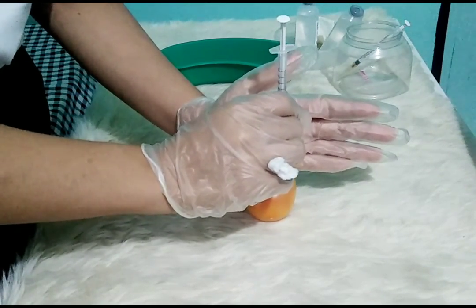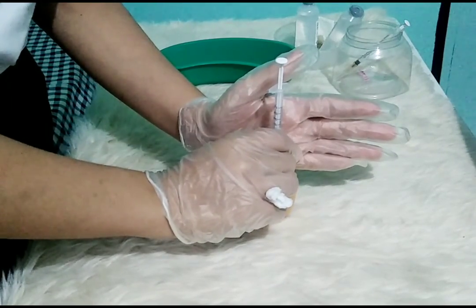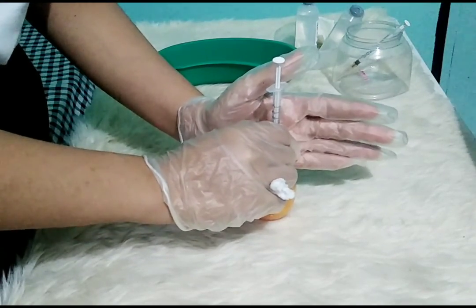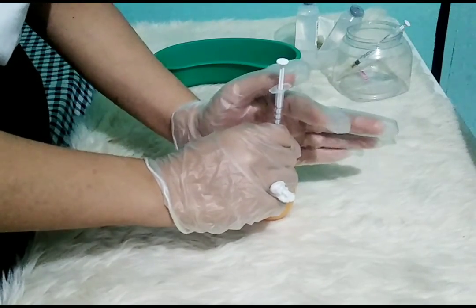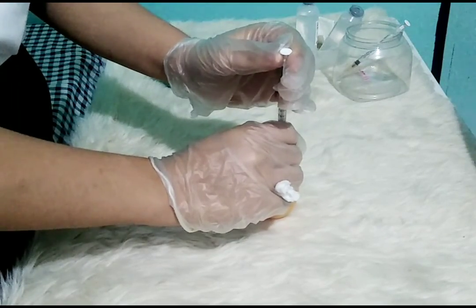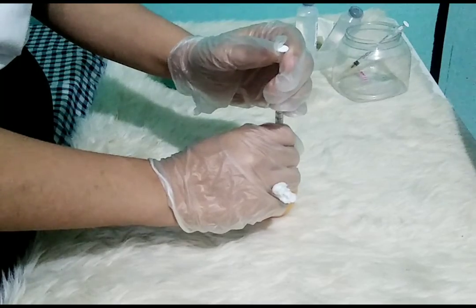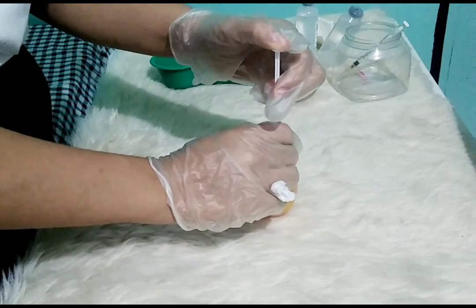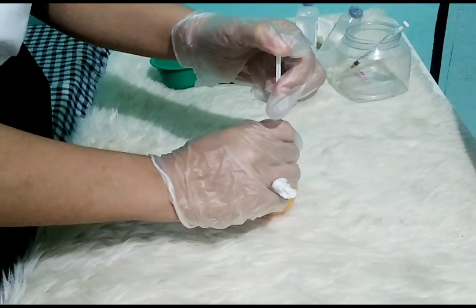Hold the syringe between the thumb and the forefinger and pierce the skin smoothly and quickly at a 90-degree angle, inserting the needle into the muscle. Hold the barrel steadily with the non-dominant hand if consistent with agency policy. Aspirate by pulling back on the plunger with the dominant hand, for 5 to 10 seconds. Inject the medication steadily and slowly, approximately 5 to 10 seconds per milliliter.